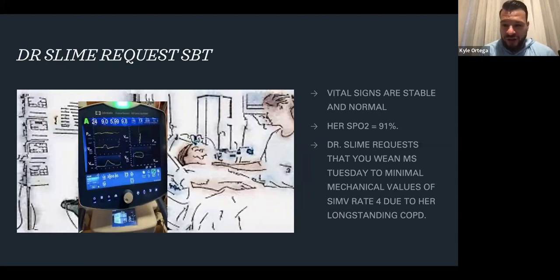And then also looking at her ABG, normal for her is going to be that COPD range. So pH 7.34 to 7.37, CO2 55 to 65, same thing for that O2, and then the bicarb 28 to 34. So we got an ABG within those ranges. So everything's looking good, so we can pull this tube, and that'll be the end of this video. Thank you.